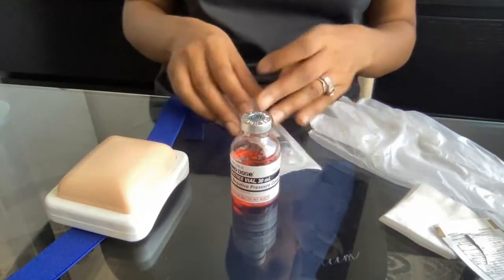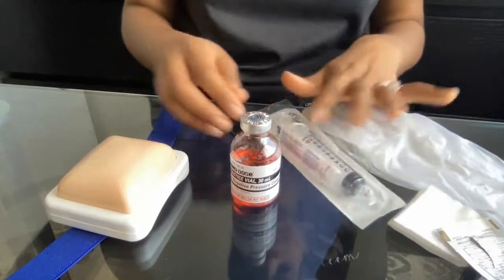Then I verify the six rights of medication administration: right patient, right drug, right dose, right route, right time, and right documentation.